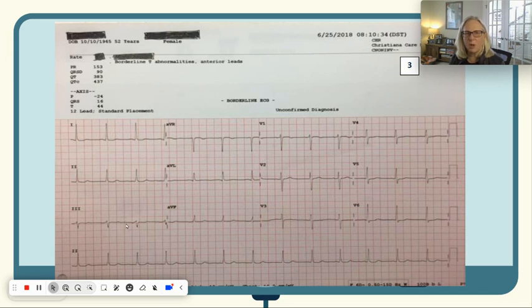What if this was the smallest? The opposite of 3 is AVR, okay? Now, this is a negative deflection, but it's definitely tall, correct? I can see, though, that this is a little bit taller than 2 boxes, and this one is exactly 2 boxes. So this is definitely going to be our tallest one, even though these kind of look similar.